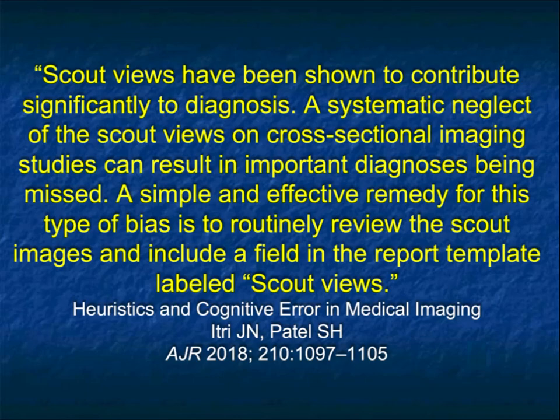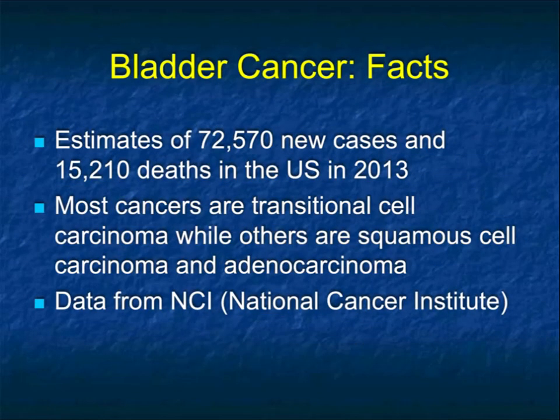Therefore, you had to say something. Scout images show nothing, or show something that's on the regular CT. But again, if you had it on a preset report, on a template, it would force people to look at it. Very, very important. So let's now go away from those generalities and get down to specific problems.